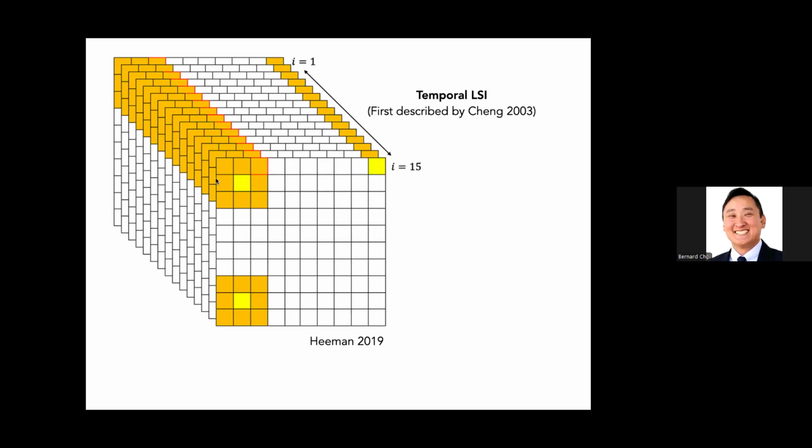Spatially would be this, just showing a 3x3. You probably want more, but this is basically a 3x3 window that you slide. Temporally, when you take one pixel, you need multiple images. You look at how that pixel's intensity varies over time. 15 or 25 images are not uncommon, and you're looking at every point XY and how the intensity changes over time.